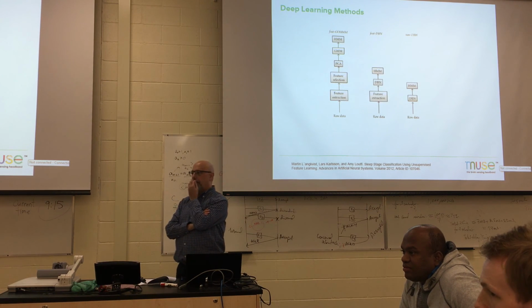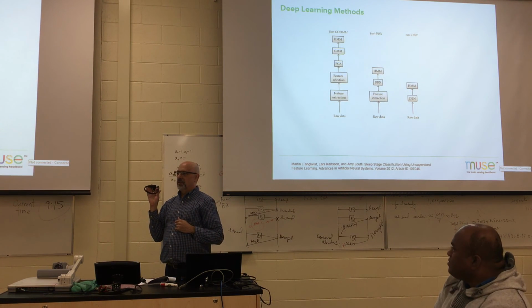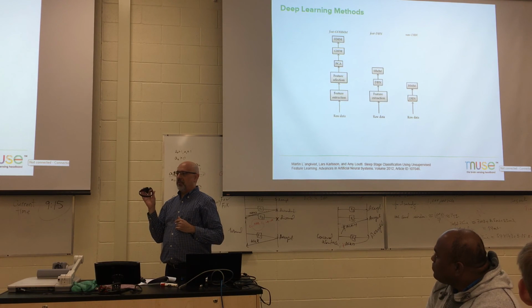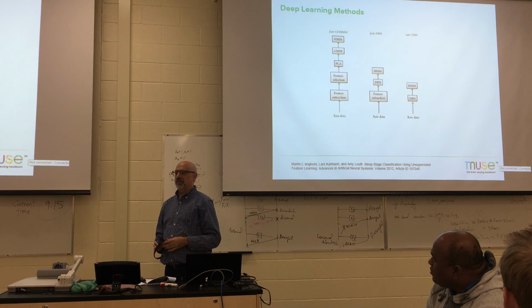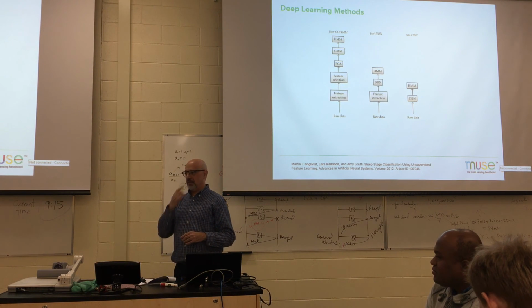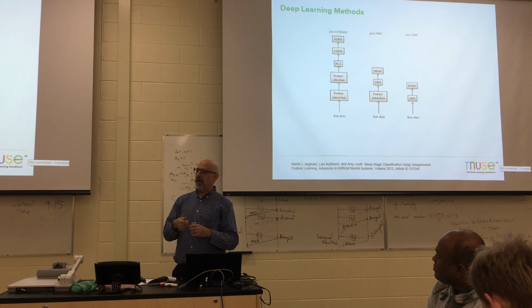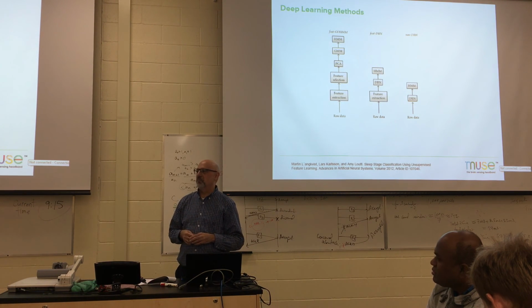Yes. What's the price difference between the Muse and the regular? So this one is $249, and a full cap system with amplifiers and batteries is anywhere from $10,000, $20,000, $30,000, depending upon how many electrodes and how fancy the electrodes are. We have a full cap system back in the office, and the electrodes light up like a Christmas tree, red, green, and yellow, to tell you which one is getting good signal.